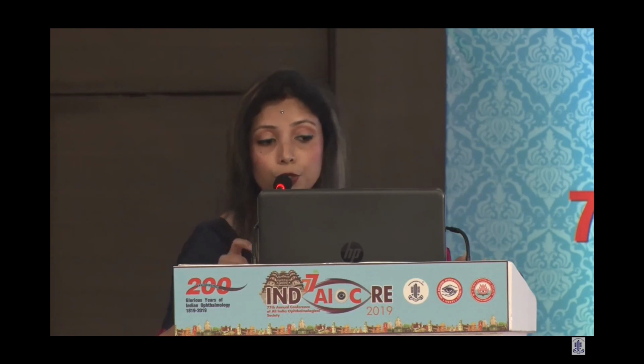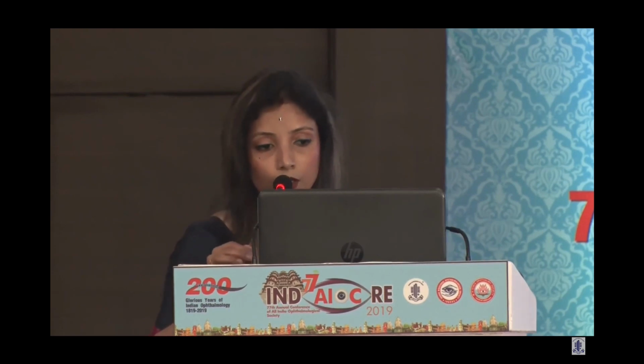It can be done in 2 ways: either aerosol spray, or if aerosol spray is not available, it can be done by mixing with potassium permanganate, and on the next morning the fumes are neutralized with liquid ammonia. For a running OT, fumigation should be done once a week. For a startup OT, fumigation needs to be done on 3 consecutive days, and 3 negative cultures need to be attained.